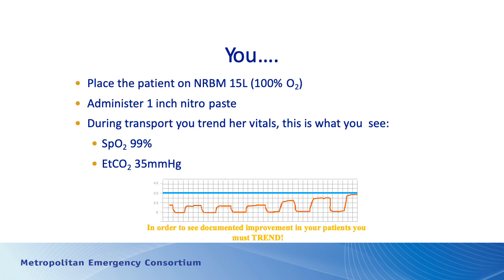With treatment, you can see that her end tidal CO2 levels have improved. It's rarely this dramatic, where you have 5 or 6 respirations and you're back to baseline, but just as a graphic representation, you see it here. So the patient's CO2 level has improved, gone back to a more normal range, which suggests that her pulmonary status is improving, particularly when you compare that to a normal O2 saturation as well. So it's an example of a patient who's hypoxic but hyperventilating, blowing off carbon dioxide, and their CO2 level returns to more of a normal value with appropriate treatment and intervention.